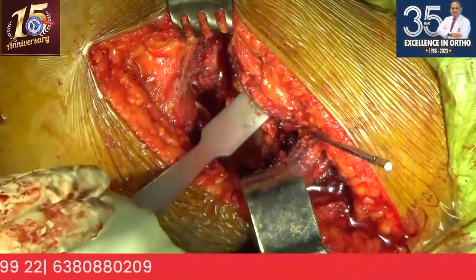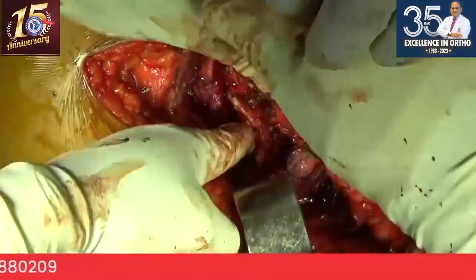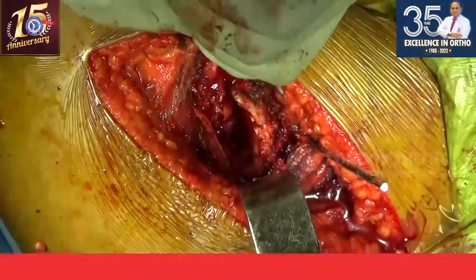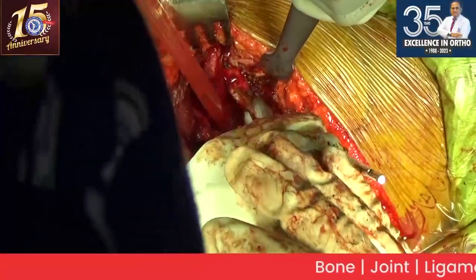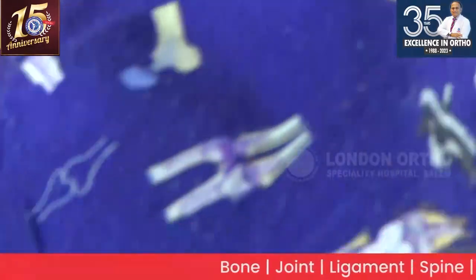So here you can see, before going into the acetabulum, I want to remove these protuberant osteophytes so that we know where exactly the superior surface of the acetabulum starts.